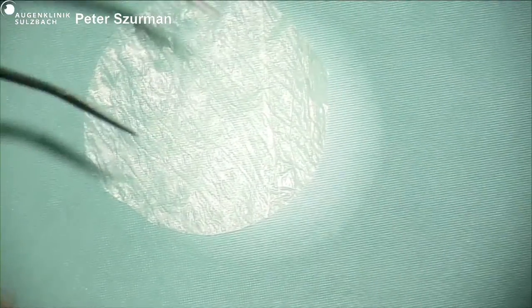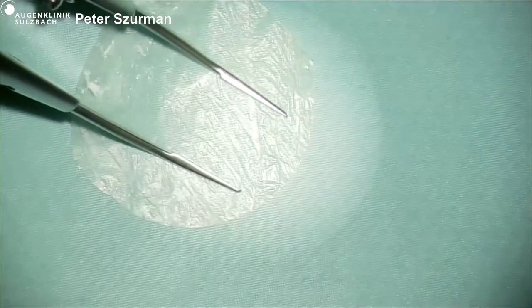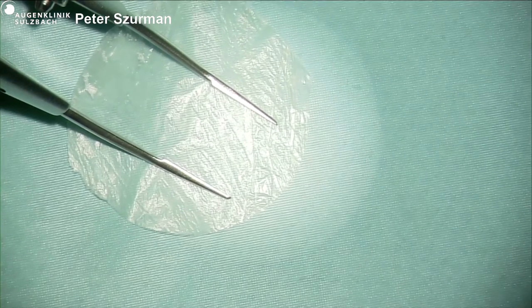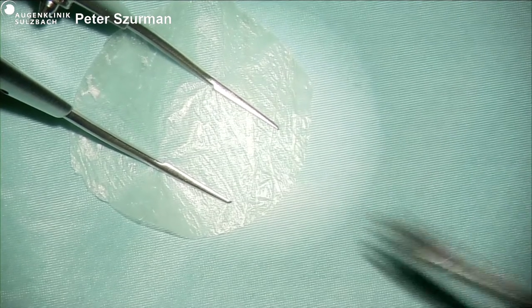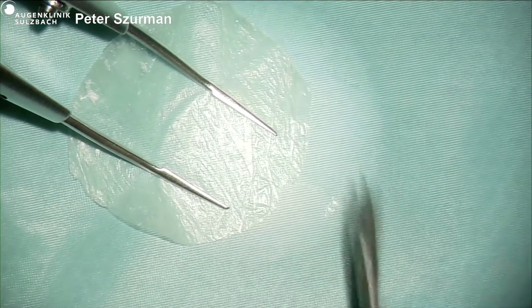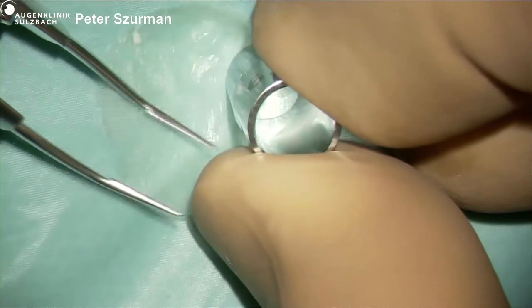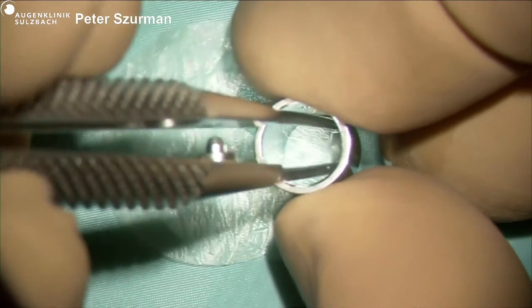Grazia, you're shaking your head. Yeah, indeed. It is pretty new for me too. Although I spoke a couple of years ago with Peter about this technique, I think it is interesting, but it gives the possibility to choose to go for a larger membrane, a larger diameter, and if you put it on top, you don't need to manipulate the subretinal space. In addition, the amniotic membrane is pretty rigid, and so it does not fit properly in the small macular hole unless you punch it to the right size of the hole.